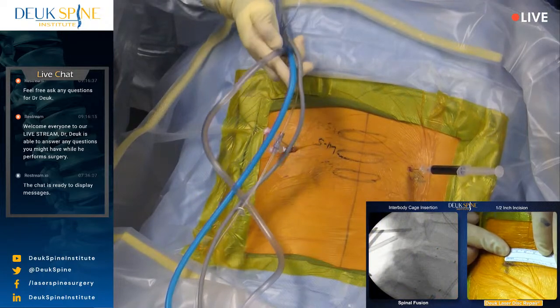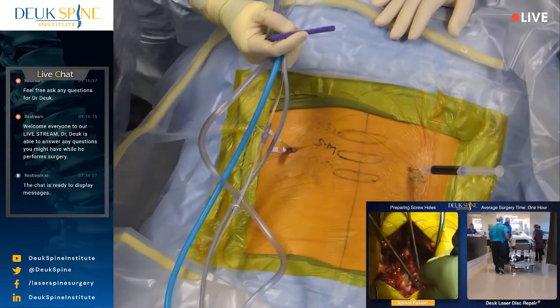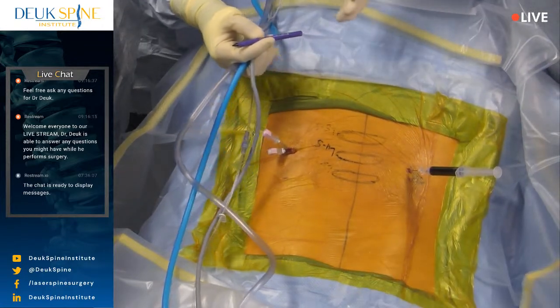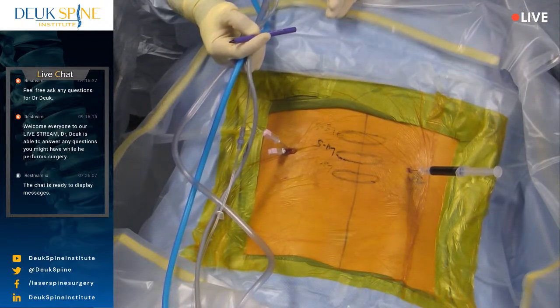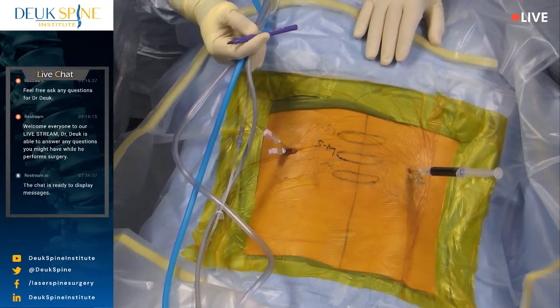You are back. So at this point, folks, we're getting ready to actually do the surgery that's going to repair the disc, which is the endoscopic part of the surgery. Before we do that, I had to, step one, prep and drape the patient. So position, prep, and drape. We sterilize the back so there's no infection that can happen. We use a sterile field, standard for surgery.